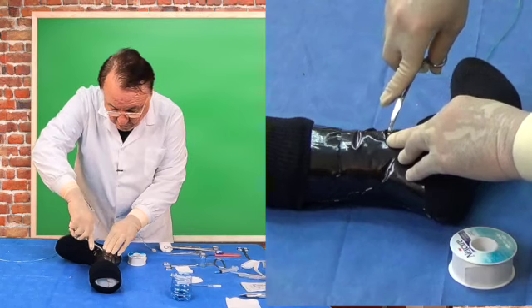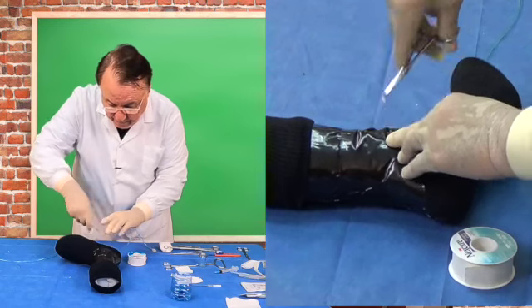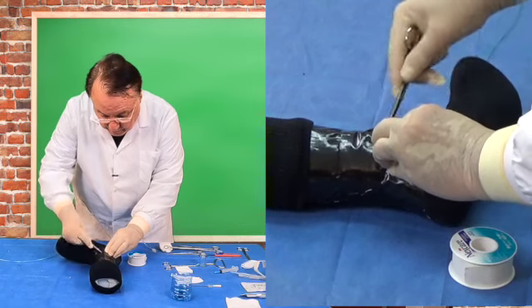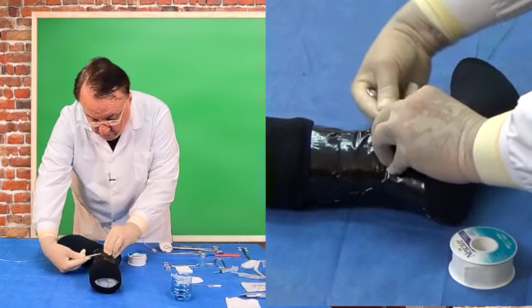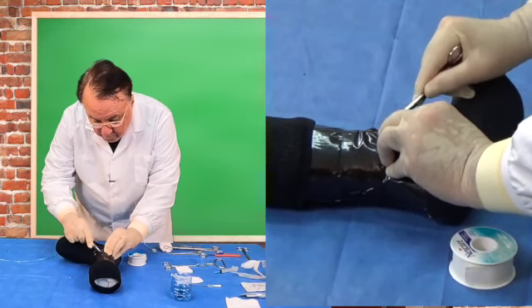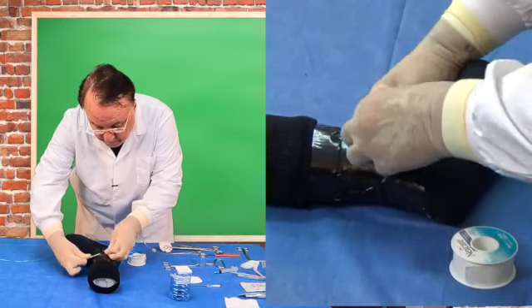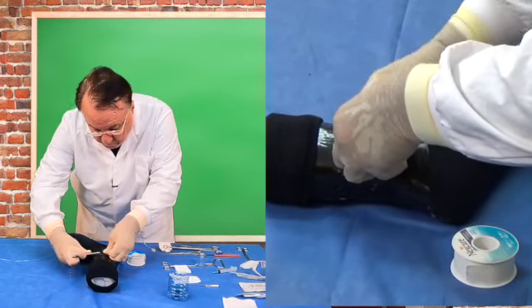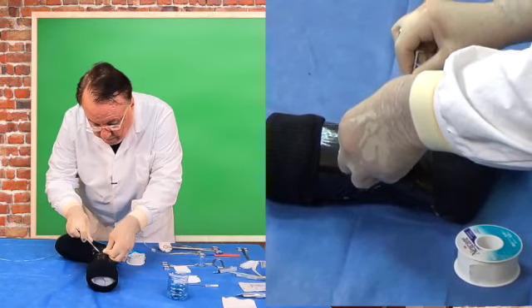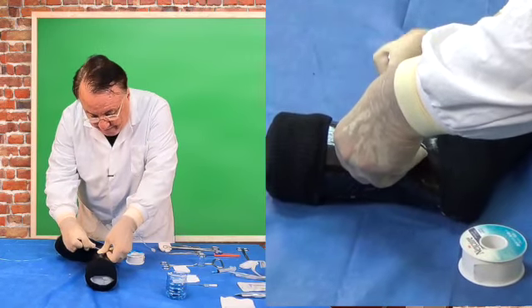Dissect a bit more to make it more visible, a bit on one side, a bit on the other side, and then I try and get my artery forceps underneath the vein. There's adventitial tissue that has to be spread, and this model has adventitial tissue as well. It's been a little bit difficult, but there is the vein.